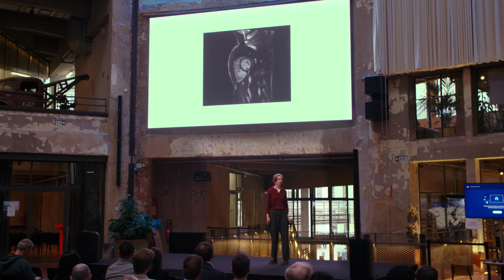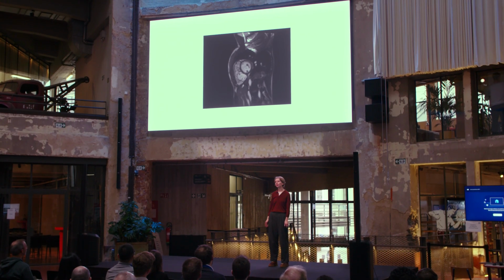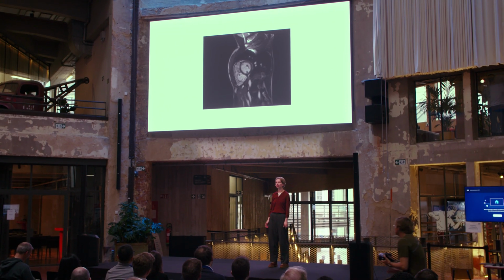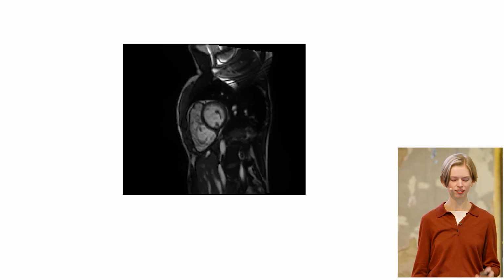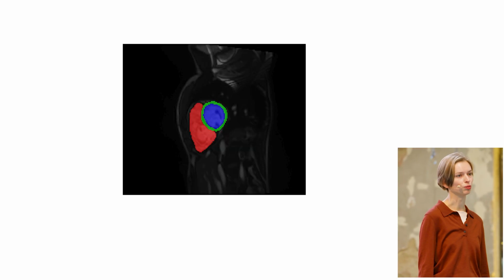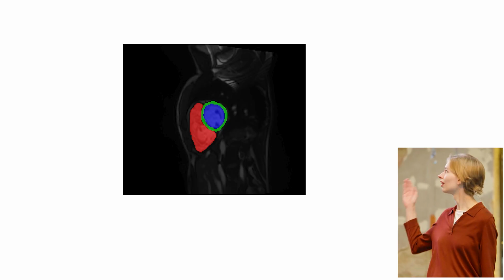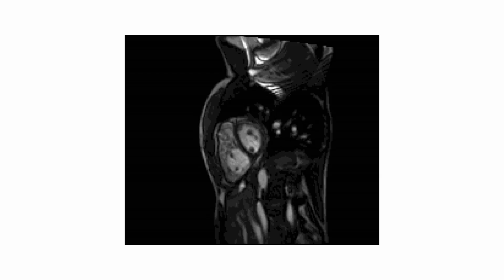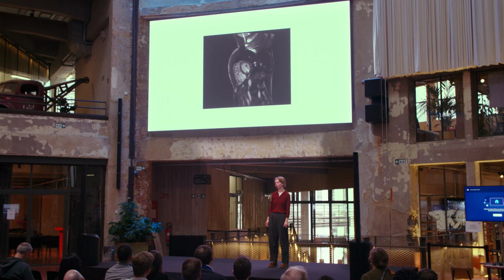If you would take a scan of your heart, it would look something like this. To now understand what this image tells us about the heart, we need to analyze the image. For this, segmentation is a great tool. These deep learning models can learn to segment shapes, like here. Luckily for the patient, this heart beats, and as you can see, its shape changes across the different images.